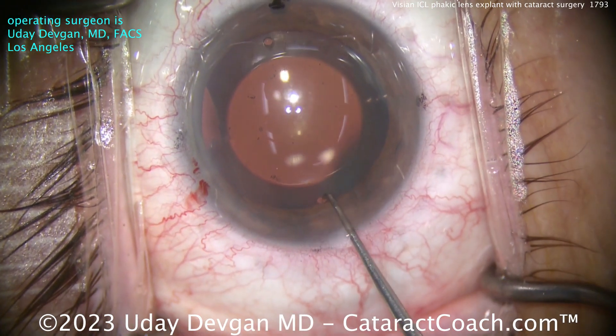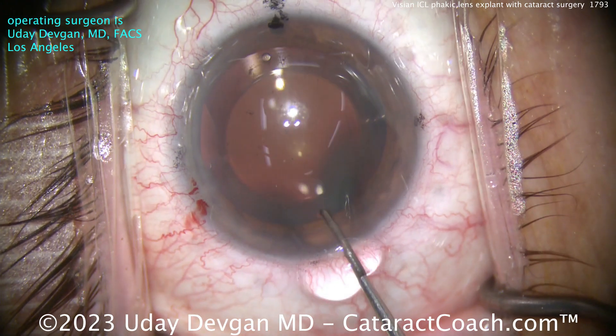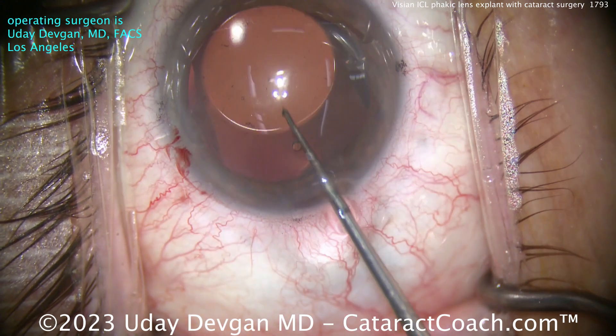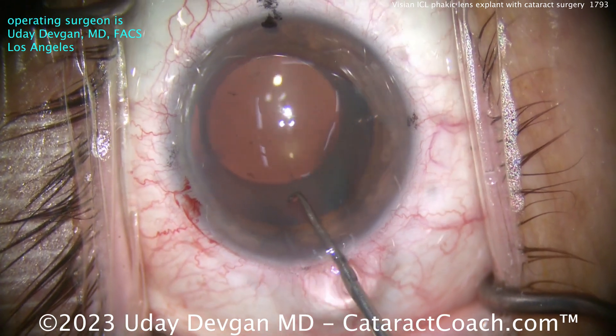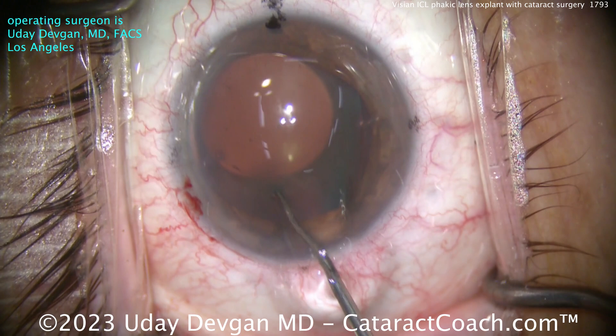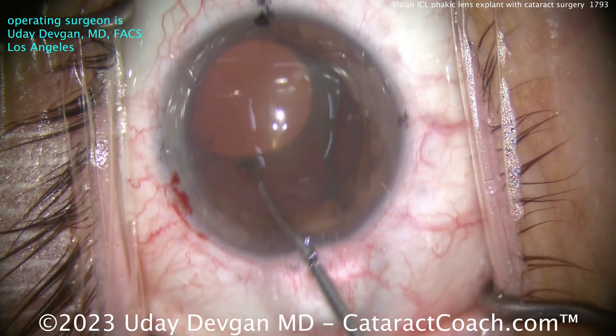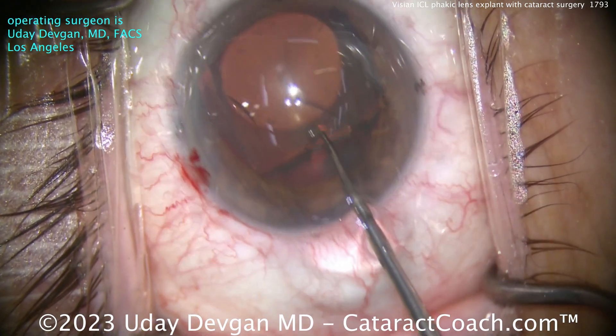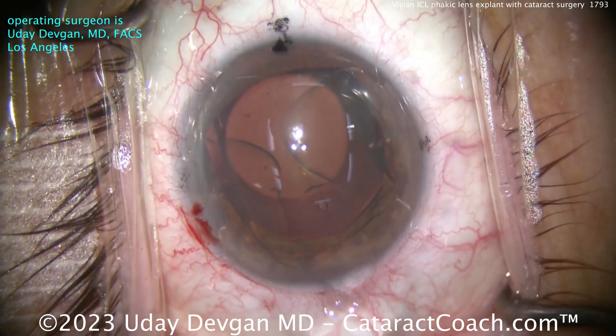With the eye full of viscoelastic, using the Sinsky hook here, getting that one eyelet, and getting that section of the IOL above the iris. We're getting that posterior chamber lens up above just these two foot plates on this side, the temporal side near my incision. I want them above the iris, just using a Sinsky hook there.